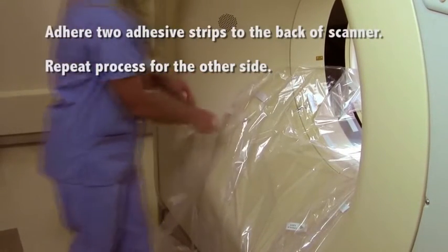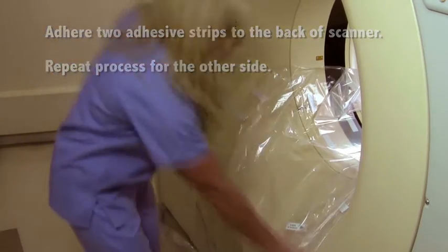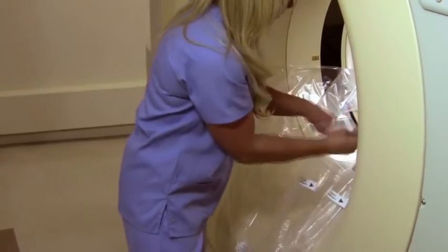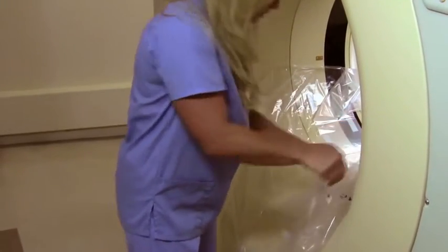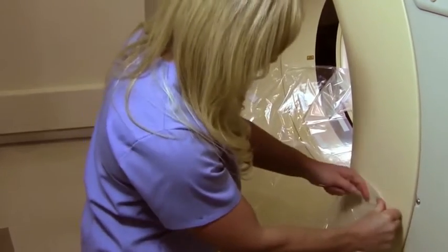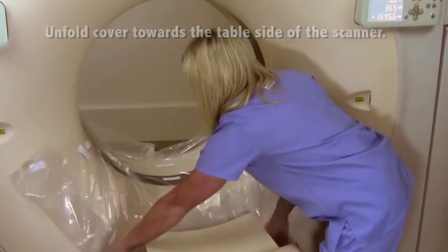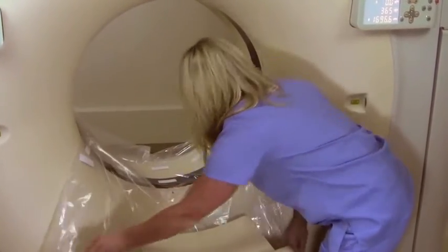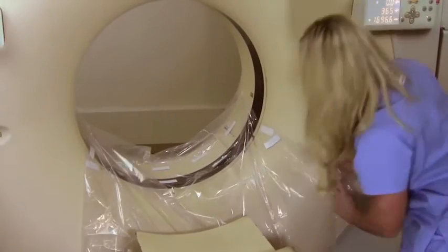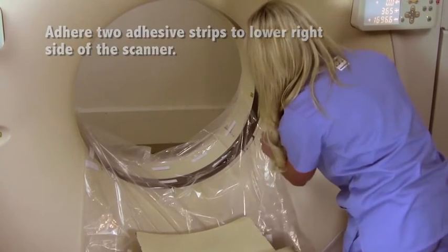Adhere two adhesive strips to the back of the scanner. Repeat this process for the other side. Unfold the cover towards the table side of the scanner.